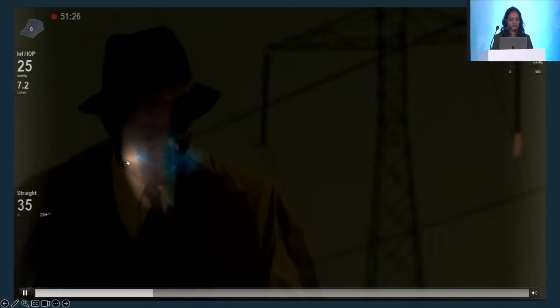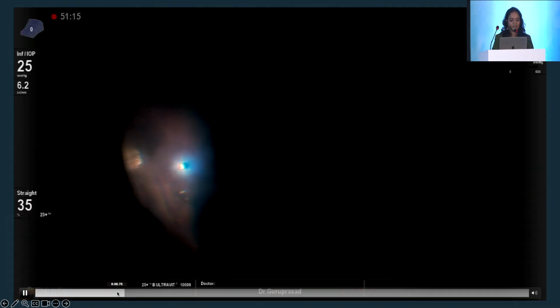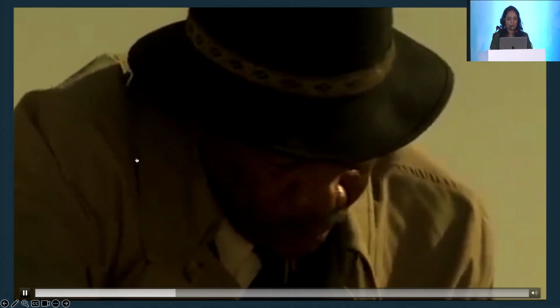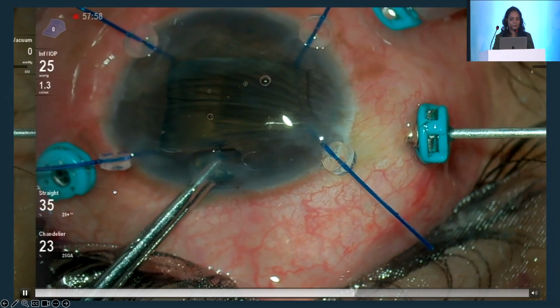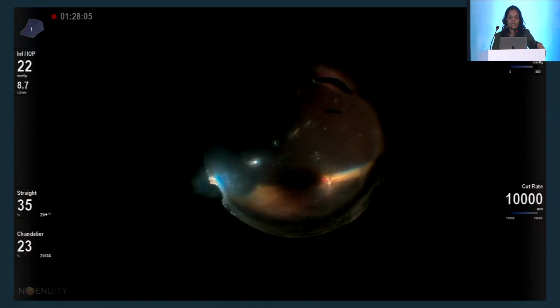Lo and behold, at the nasal edge of this retina, at the retinectomy margin, anterior retinectomy flap, there was something shining back at me, glistening, and I was horrified to find a human head in the box, Morgan Freeman. I found an intraocular foreign body in this eye. I was as horrified as him. Under this anterior flap, there was a foreign body, and it was hiding under the retinectomy edge.